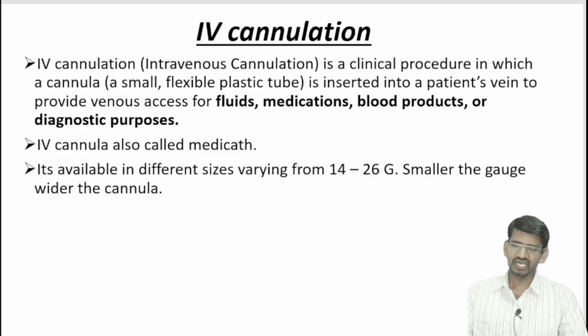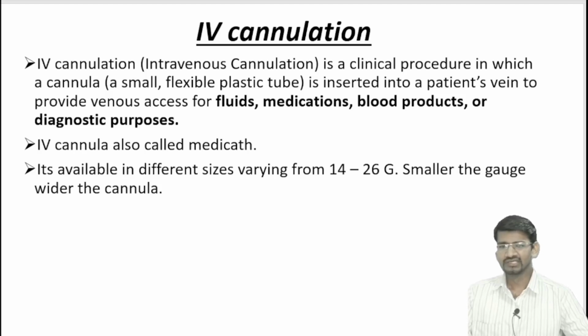The IV stands for intravenous. Cannulation means where we insert a cannula.